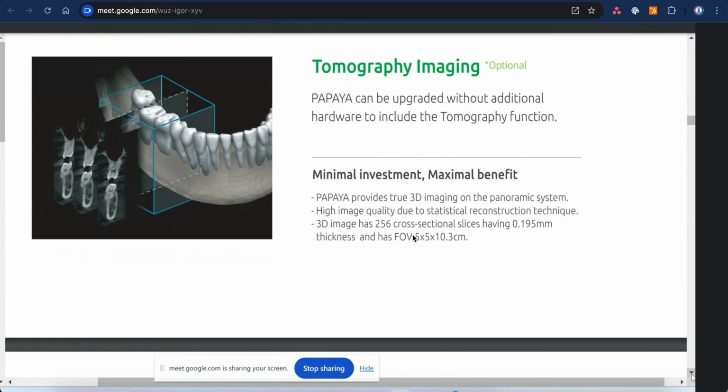So when you say tomography, doctor, is it just changing? As I told you, it's like in implants, also in endodontic treatment. For example, if I'm doing endodontic treatment and there is a missing canal that the dentist forgot to clean and fill, and it's a source of pain. When you use the 2D image, everything looks clear and the treatment is correct, but then I can use the tomography to discover that. So this is just related to cost, yeah? Yeah, exactly, this is cost.